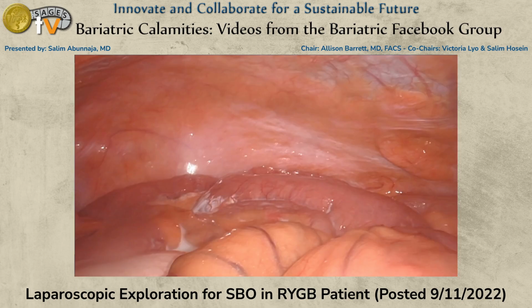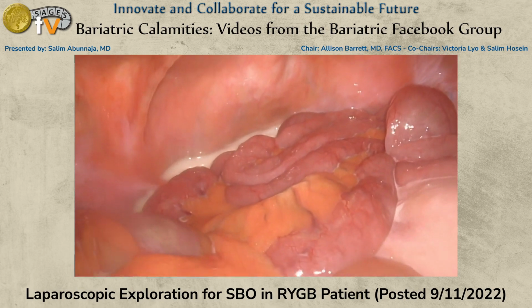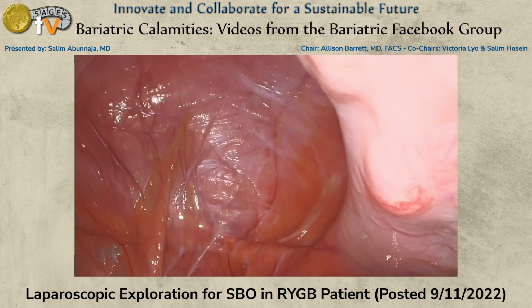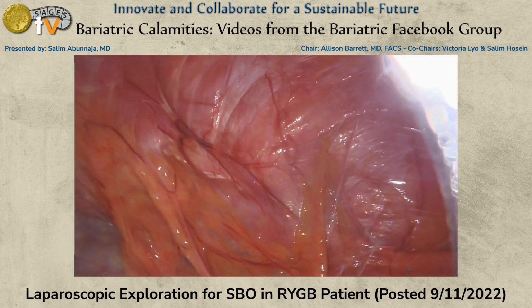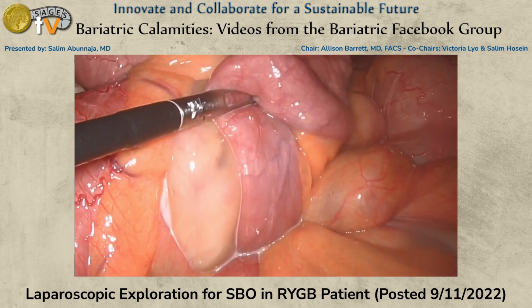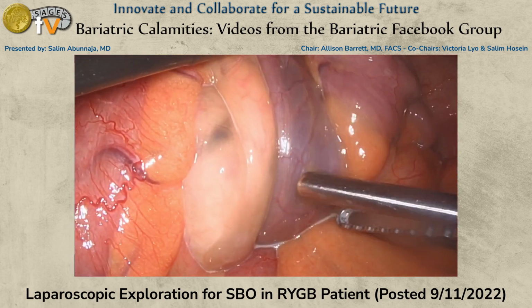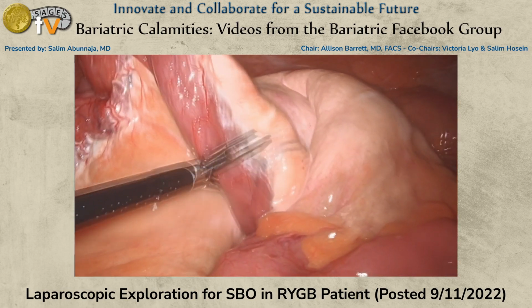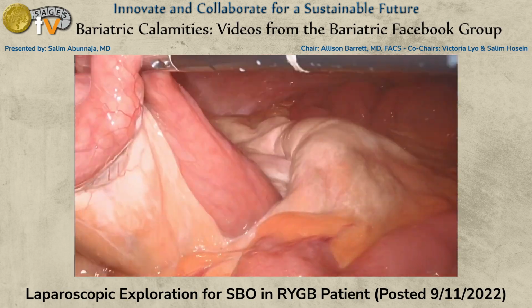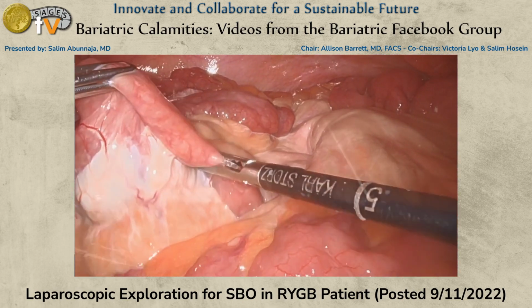And to my surprise, you get in, and any experienced bariatric surgeon will see that chyle ascites all over the abdomen. And surprisingly, there are no adhesions in the abdomen. And that big hernia is completely empty. There's nothing. It's probably one of the easiest internal hernias I've ever done. It was a very straightforward, simple release of all the small bowel, just pull, and the entire thing just came out very easily. And I think the reason why she probably lasted almost 2 months from the beginning of her symptoms is that the JJ defect was so big.